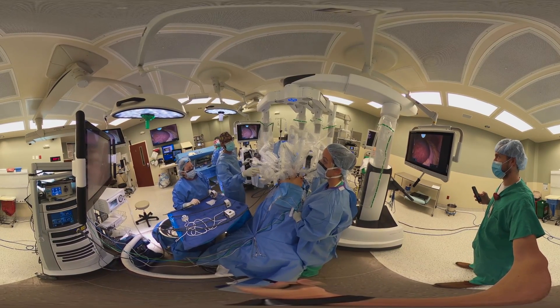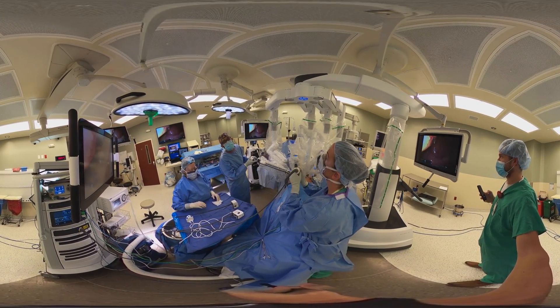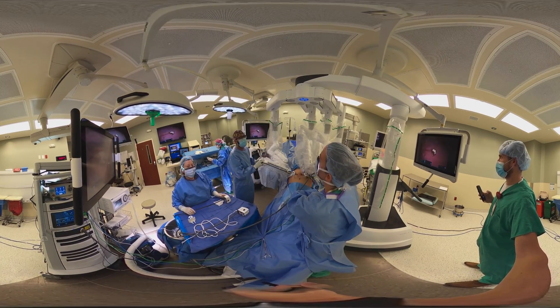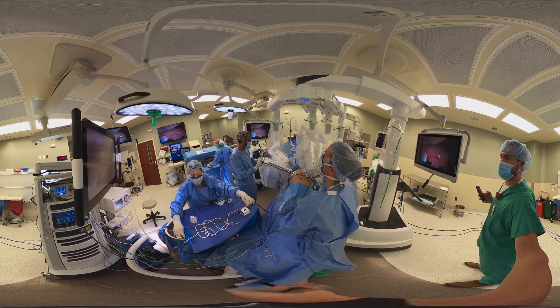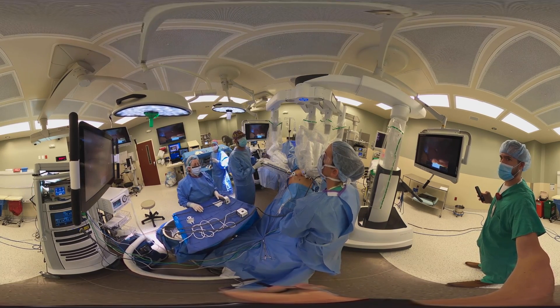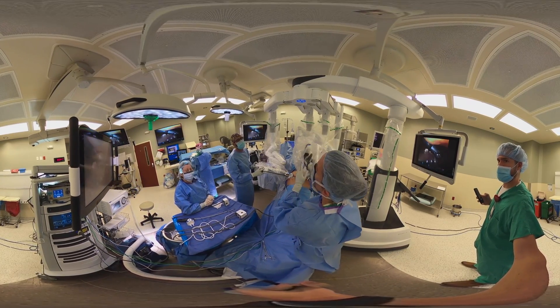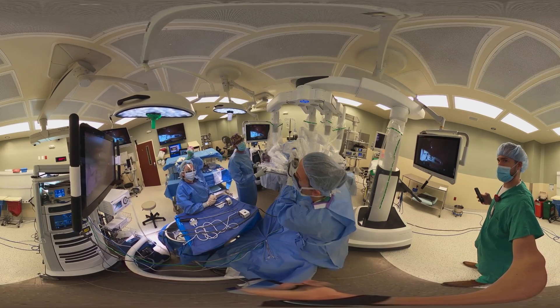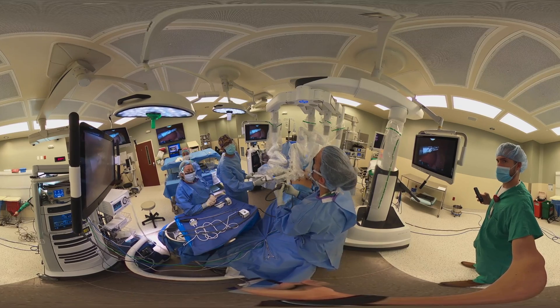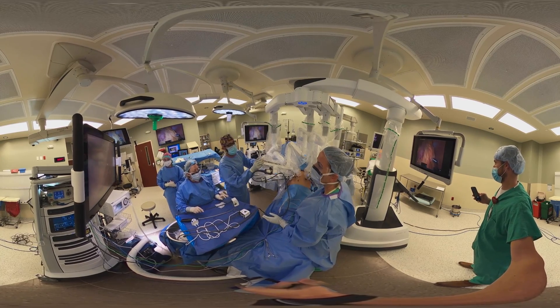We're looking here — the camera is pointing into the left upper side of the belly. What you see on the left of the screen is the liver, and we're now looking up into the right side of the belly. In a second you're going to see a robotic instrument enter the abdominal cavity. That blue-green structure in there is the gallbladder, and here's our instrument coming in from the right side. The fatty ligament in the center is called the falciform ligament and it suspends the liver. The pink sliver behind there is the stomach, and that's what we're going to be operating on today.